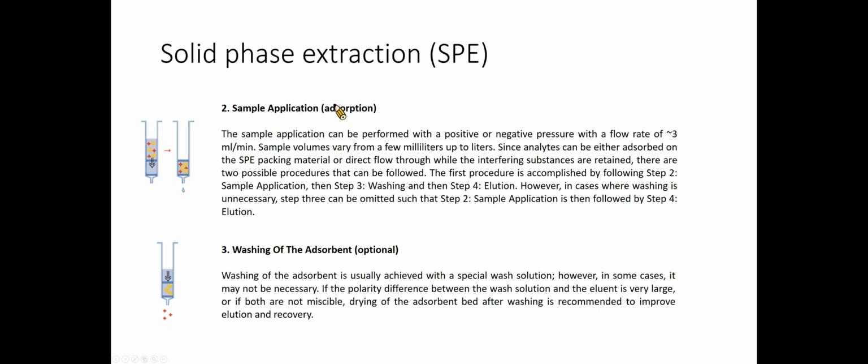Ideally, the washing step can get rid of the interference but keep the analyte of interest in the adsorbent. If the adsorbent cannot retain the analyte, then the washing step can be omitted.